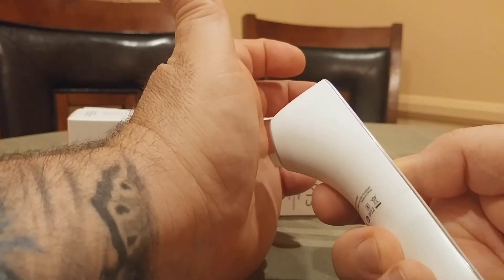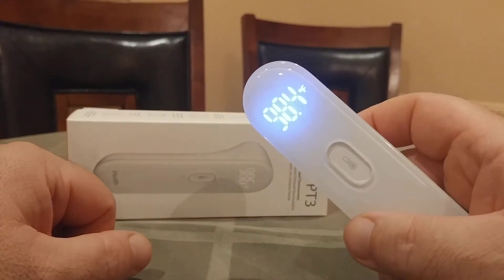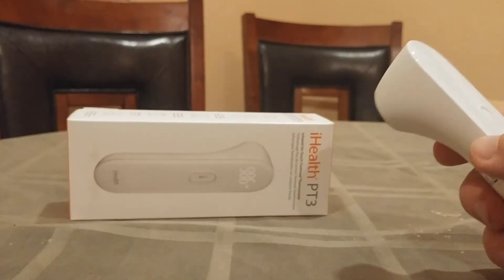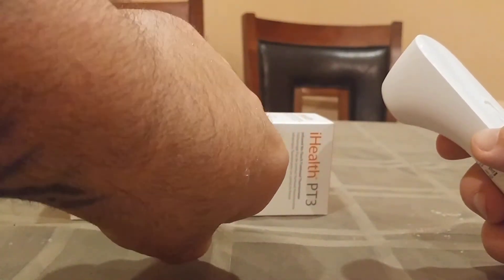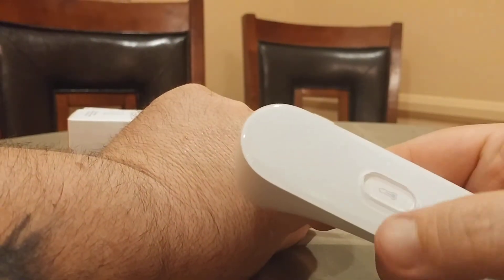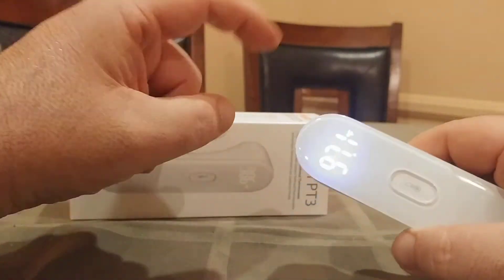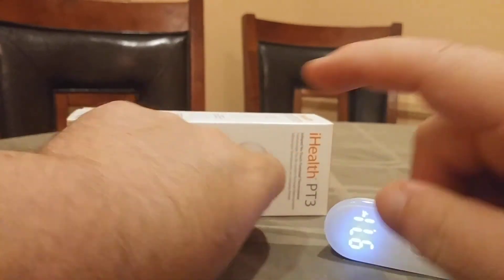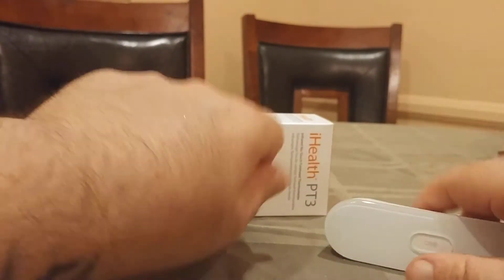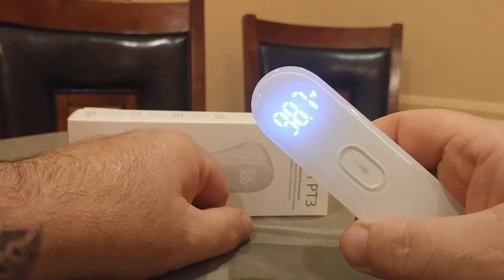I'm going to press and hold the button like this and I get 98.4 degrees, as you can see right there, which is definitely more accurate than the back of my hand. So if I lick the back of my hand — I don't know if you can see that moisture, see that glistening — and if I take the temperature: 97.1. So you can see there's a huge difference between the device taking the temperature of sweat on the outside of the hand versus taking the temperature of the inside of the hand.